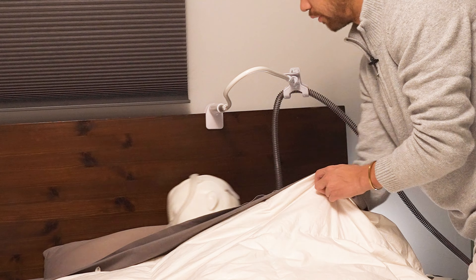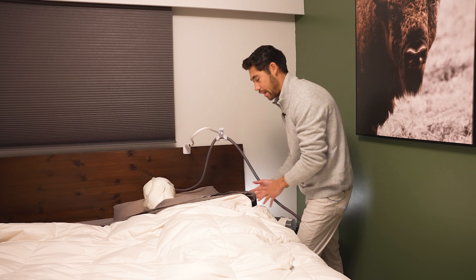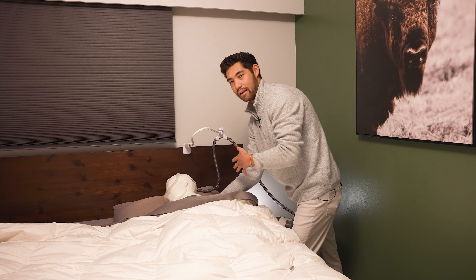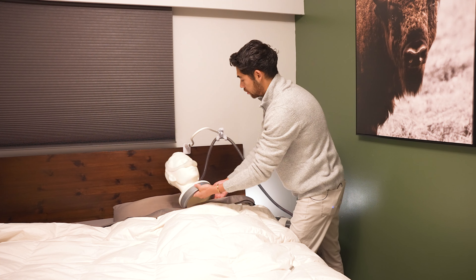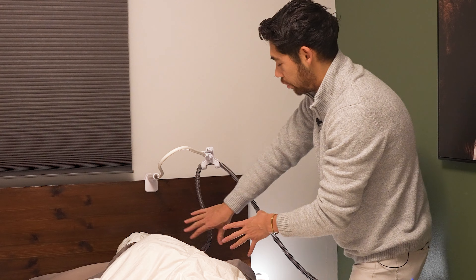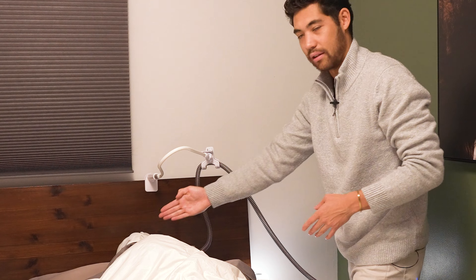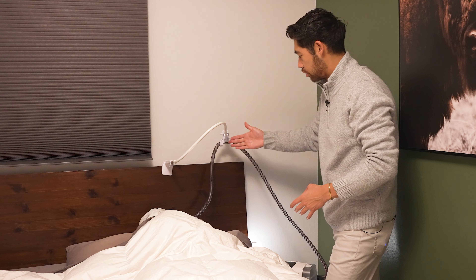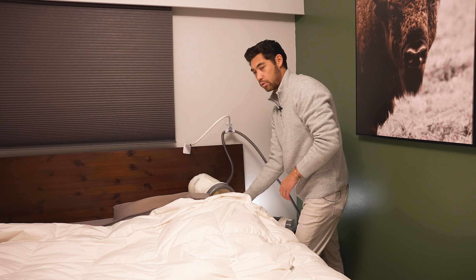If he were to slide over, he's not feeling any additional weight. The tube is not dragging on the pillow or getting caught at the bottom of the pillow — it's simply kind of airless and light above him. If he turns again, it's not in his way at all. Because there's no weight on the tube bringing it down and it's pushed away from his face, it's not tangling him at all. We can even bring it more back toward the wall, lifting the tube way out of his face down to the machine. As he rotates, there's no spinning.